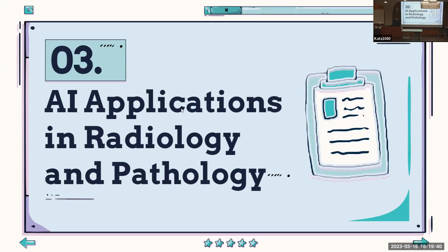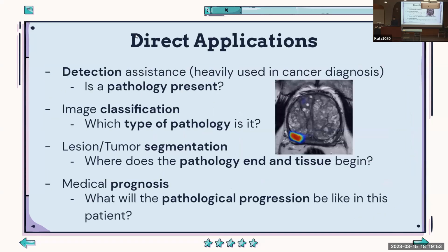All right, so we talked a little bit about the big challenges, the grand challenges in radiology. Now we're going to move a little bit into how AI and ML can help us maybe address some of these issues and the cool ways that they're being used. So a couple of ways that AI is applied right now directly. And by directly, I mean, oh, we got some actually more nice errors in the chat. Thank you, guys. So in terms of direct applications, this means when the radiologist is looking at a scan in the process of making a diagnosis, how can AI be applied?